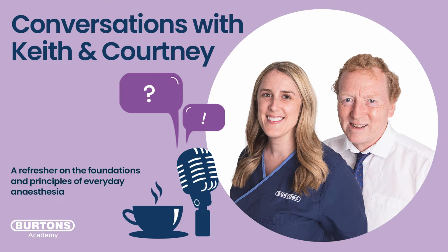You have to assess it, and it's not possible to say there's a 5-minute cutoff or a 10-minute cutoff. Because it's very rare, in my monitoring experience, that you just get this hypercapnia and nothing else happening in the patient. I find that there's definitely other things going on with the patient as well. So we're not waiting for 5 or 10 minutes to action the hypercapnia.